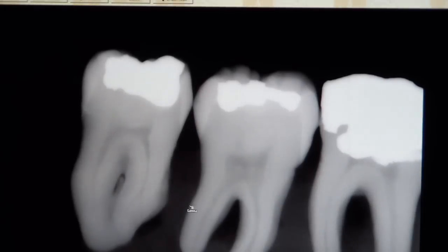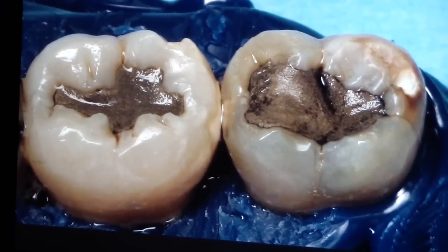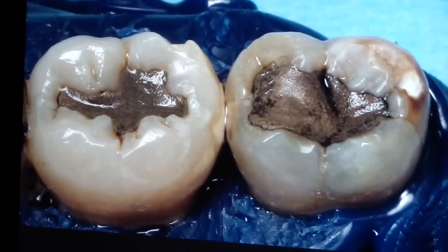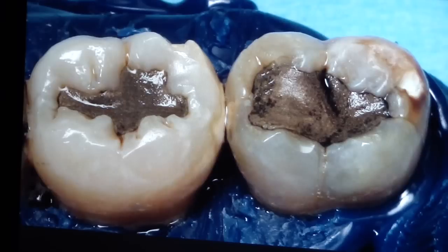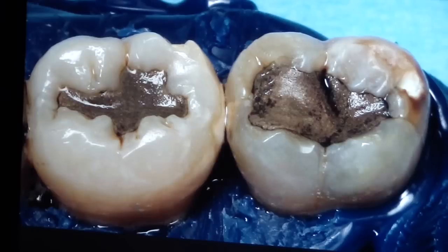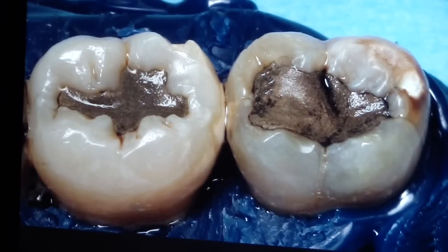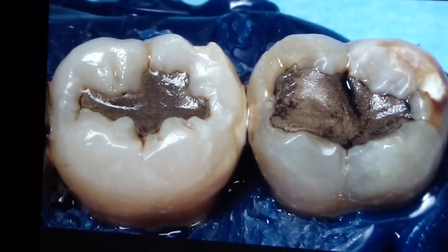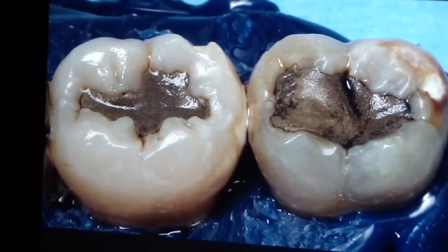The trick is you have to get the radiation to go through the contacts in both the lower and upper at the same time to open the contacts in a bitewing. If you have only the mandibular contacts open but not the maxillary contacts, then take a radiograph, look at the orientation of the contact, and just move your x-ray cone and align it to the contact point of the maxilla. You might get an overlap on the lower, but you will open up the contacts in the maxilla. You have to individualize your bitewing based on the orientation of your contacts.